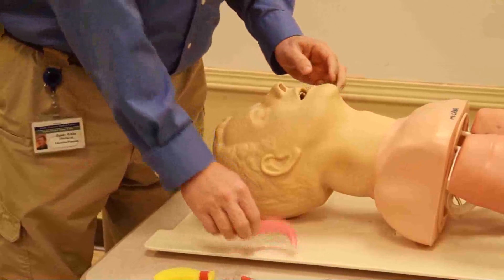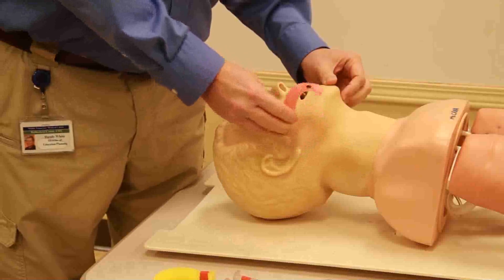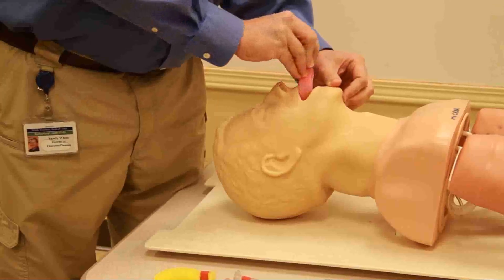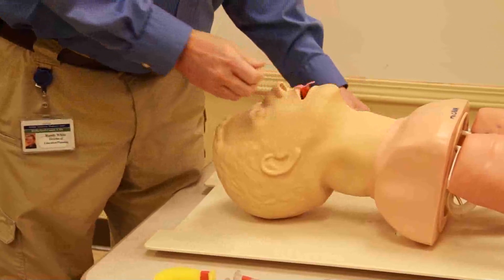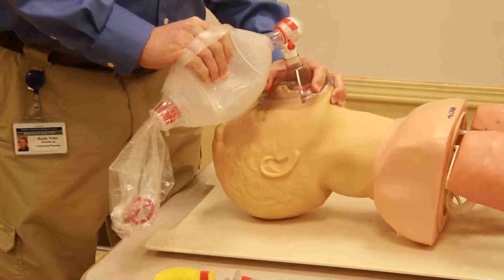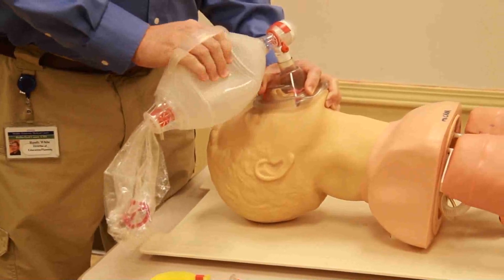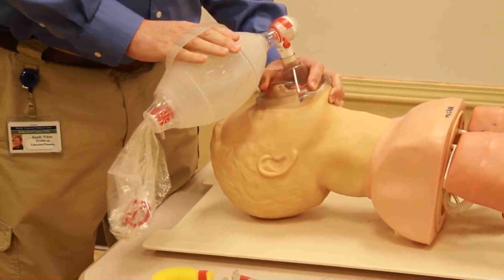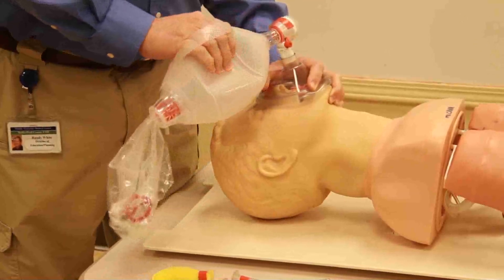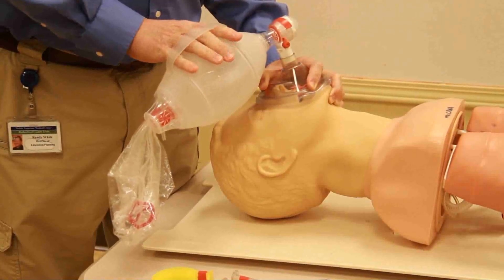Once I get two ventilations in, I'm going to place the airway. I measure off my airway, go in upside down, rotate as I meet the hard palate, then continue bag valve masking the patient once every five seconds. I also want to make sure I connect my oxygen to my bag valve so that my patient is getting 100% oxygen.